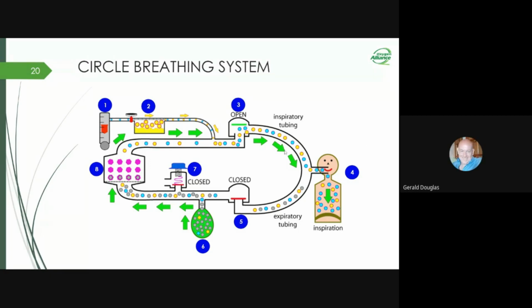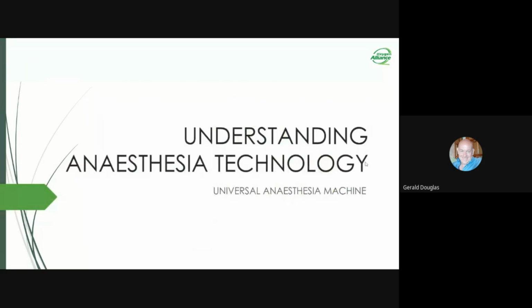Great, thank you. And I just saw a comment from Deb, and I'd like to comment on that, and maybe also a follow-up on Robert's question. I think generally we have struggled with measuring oxygen concentration. We primarily have used two of the different oxygen analyzer technologies, the ultrasonic analyzer and the electrochemical analyzer.